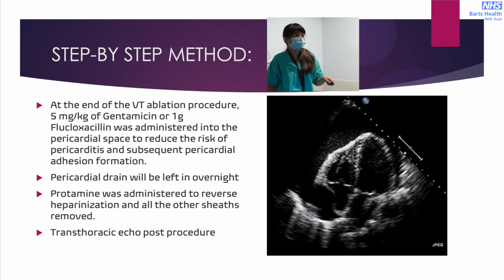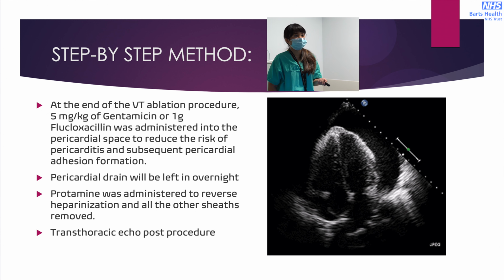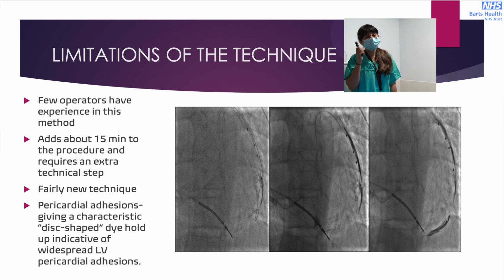So this is not the transthoracic echo that you would like to see after the procedure. This is pericardial effusion, for those of you who don't know. That's cardiac tamponade actually. So the limitations of this technique is that only a few operators for the moment perform this. Only 2 of them in the department. But they're encouraging more consultants to perform this procedure, the overriding goal being to perform epicardial puncture safely. It adds 15 minutes to the procedure and requires an extra technical step. It is a fairly new technique, and pericardial adhesions can be encountered during the procedure.